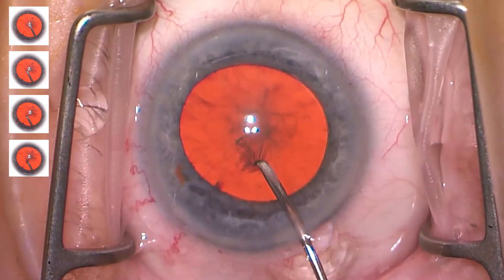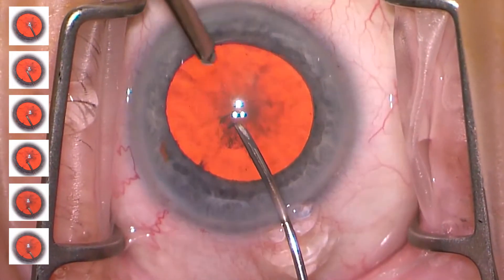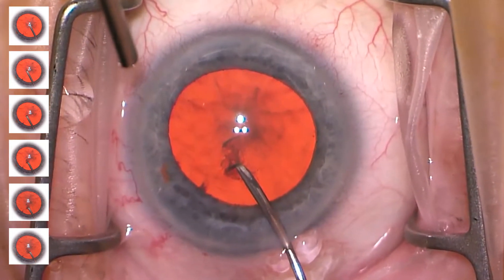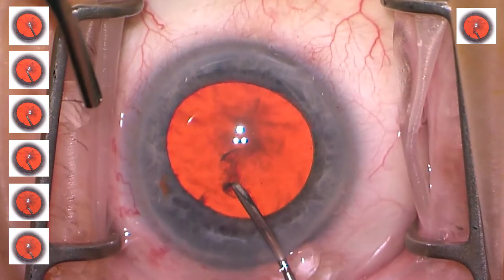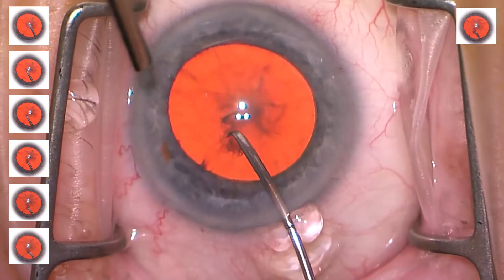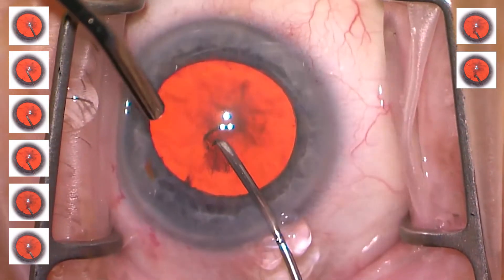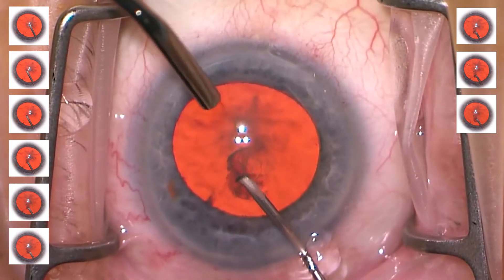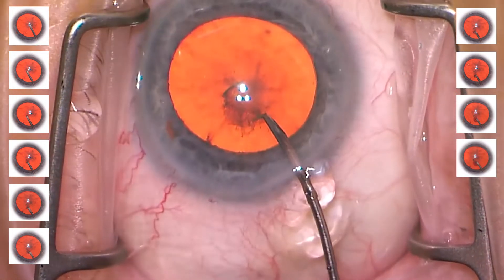You can see how by this stage we're getting some nice wrinkles, and rather than push down and make those wrinkles convert into the actual rhexis, they're strummed almost like a rubber band or a guitar. Then the wrinkles go away, the tissue springs back, and we really don't get a flap. We do have a lot of cortex being stirred up here. This section takes about 54 seconds, but we will eventually get a flap — you can see it begin to develop, and there it is.